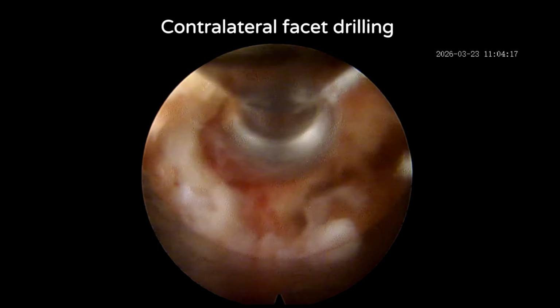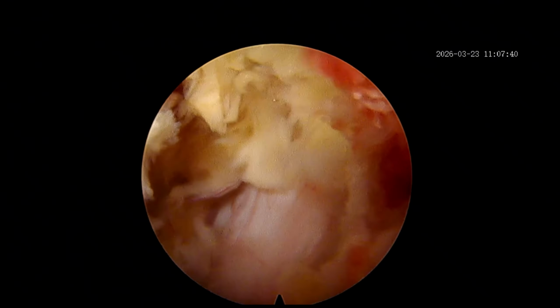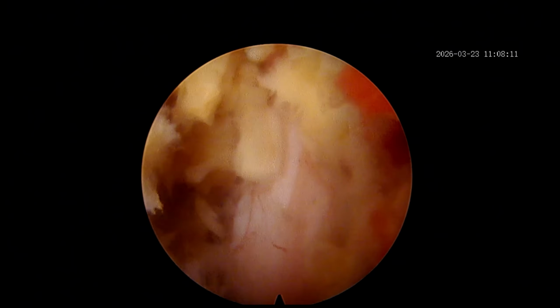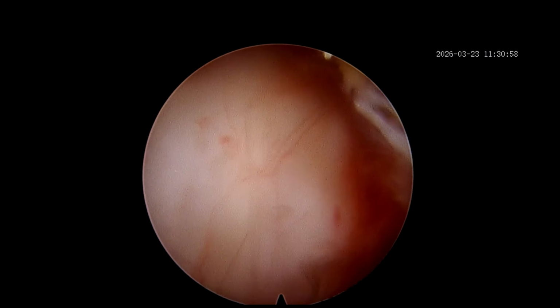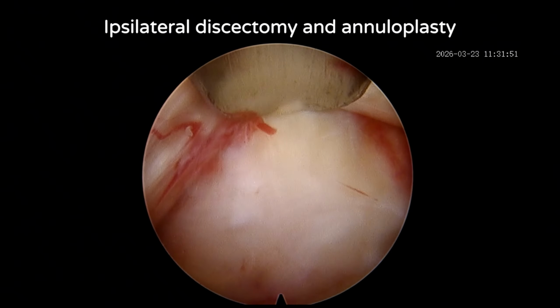So after the ipsilateral facet drilling, you should do the contralateral facet drilling, as this is a very narrow canal, and using your Kerrison number 2 and number 3, go slowly, always see the dura, and do the flavectomy slowly. You can see the lateral recess is very tight. You have to be careful. Use the water irrigation medium, as it always separates the ligamentum flavum from the dura.